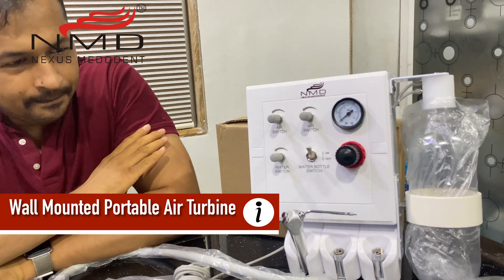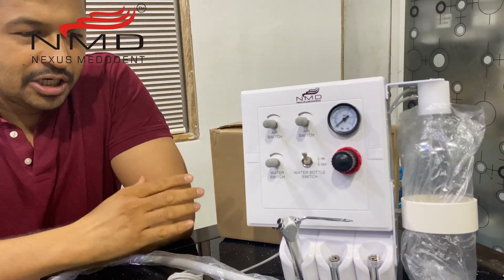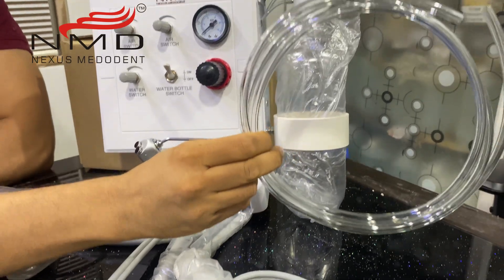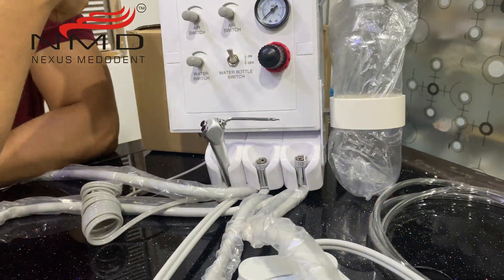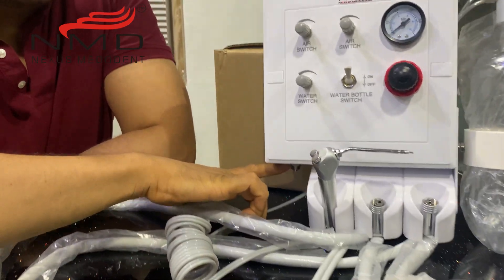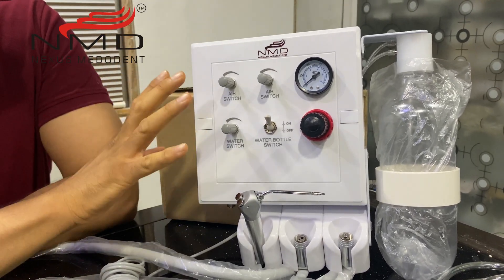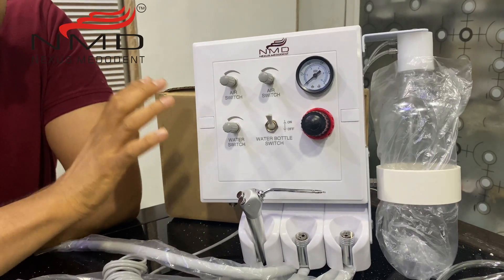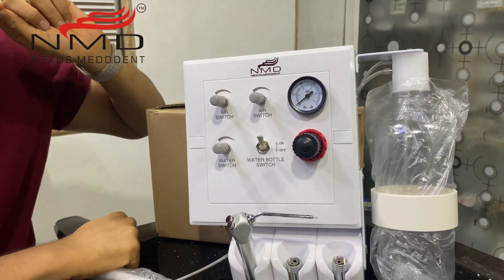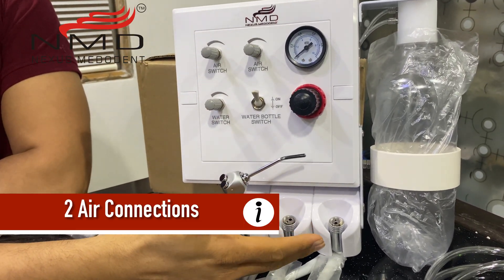By itself it's a complete dental unit and all it needs is just an air supply, which can be drawn from your existing compressor. You connect a T and the pipe — already given 8x5 — you just connect the T to the main line coming to your chair, give air to this line, and this machine will get the air supply. This machine itself is a complete mini portable dental unit. It can be mounted on a wall — there is a wall mount slot on the back side — so it does not occupy any space. As we see, there are two aerotor points, two high-speed connections.